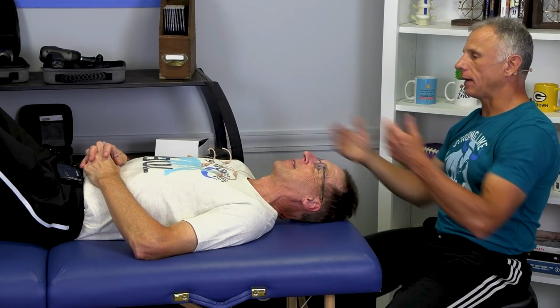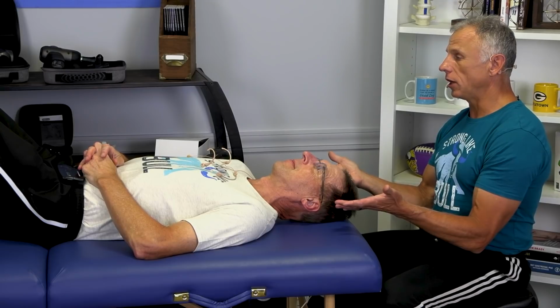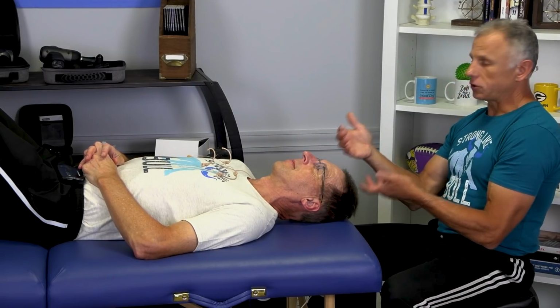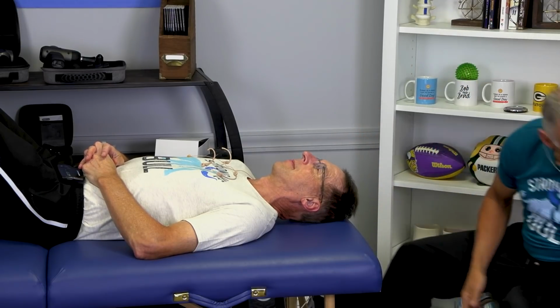And as a result, I may have him get up. We won't do this here. Have the person get up, walk around a little bit, and still make sure that the symptoms have stayed improved, because when you go upright, things change a little bit as far as the forces on the neck. Now, if that all goes good, I don't like to just do traction over a minute, and we want to get more than a minute.